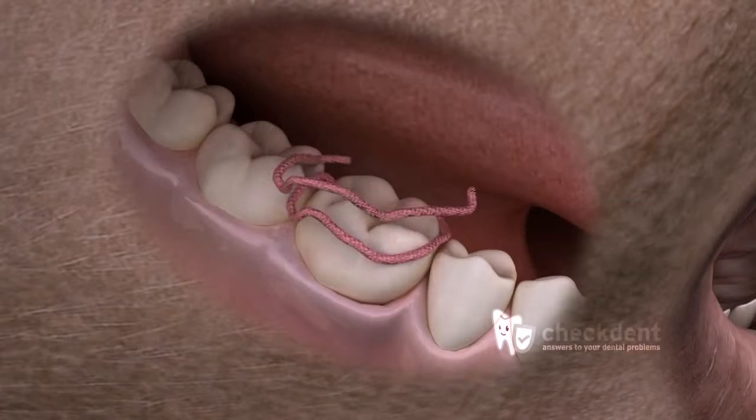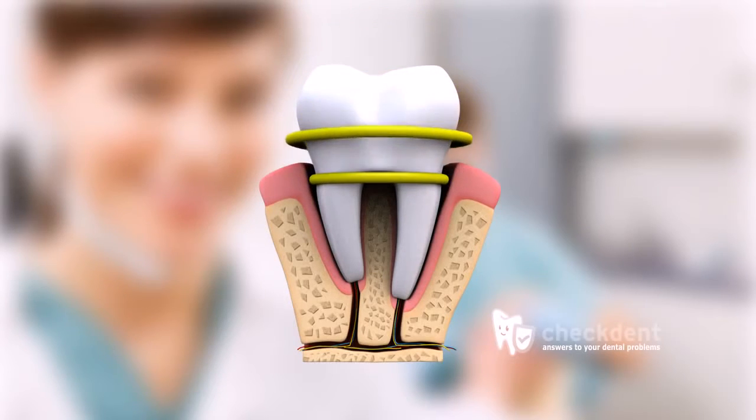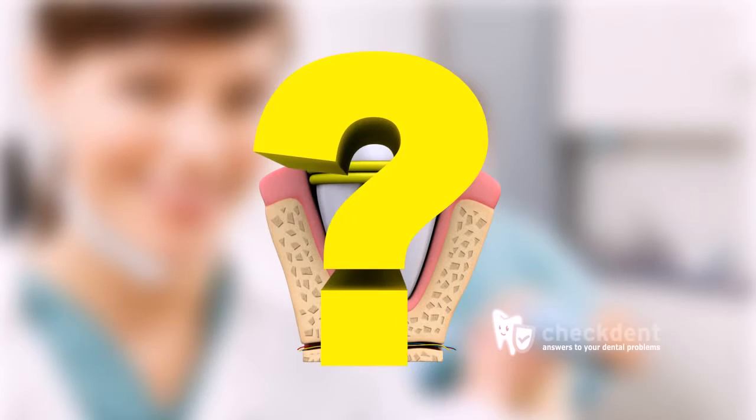Why are gingival retraction cords necessary? First, because the gingiva must not be cut, and second, because the preparation margin should be placed in the so-called sulcus, in effect below the visible border of the gingiva. The first gingival retraction cord deflects the gingiva to one side in order to avoid injury while cutting. It also ensures that the preparation margins are placed in the sulcus. Fair enough, but why 2 gingival retraction cords?